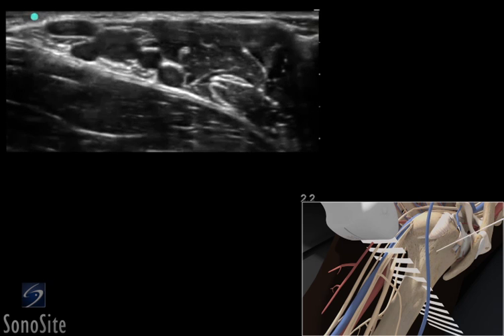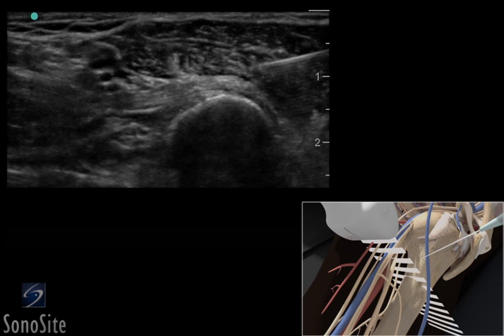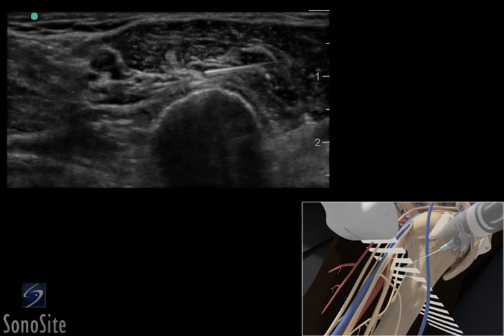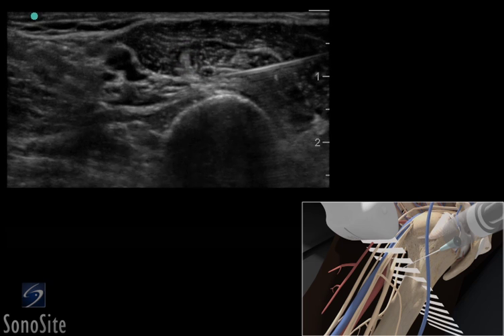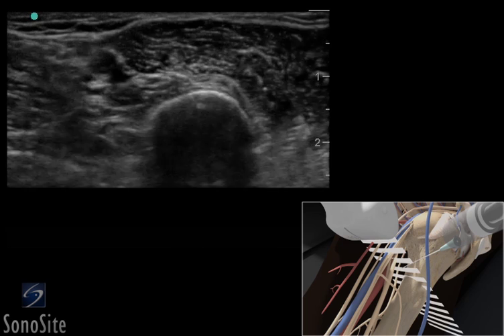The needle is positioned one to two centimeters lateral to the transducer and advanced using an in-plane technique. The needle path is directed through the biceps muscle toward the musculocutaneous nerve. The initial endpoint for the needle is immediately beside the musculocutaneous nerve, where three to five cc's of anesthetic should be injected.